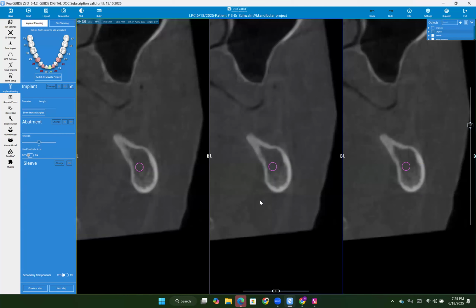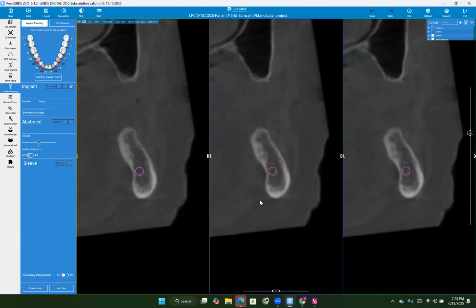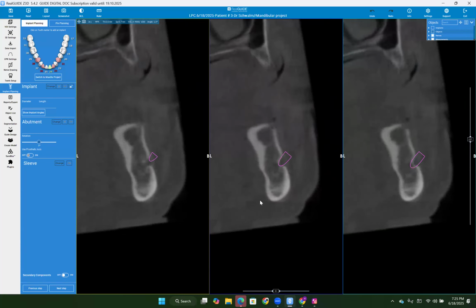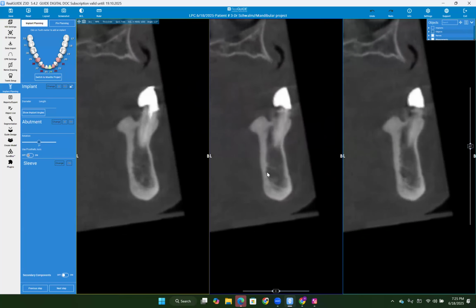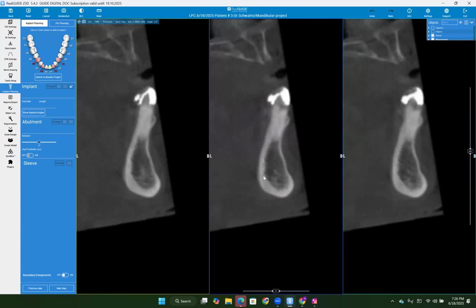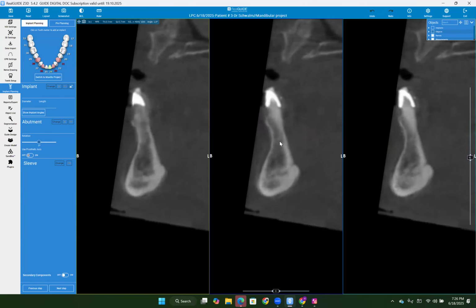She does, and we'll be removing those at the time of surgery. That way she's sore once. Absolutely. I was also planning on part of the reduction is just because it's not huge, but there's kind of an hourglass tendency in the anterior, so it'd be the only way to get good restorative space as well as good bone for the implant platforms.